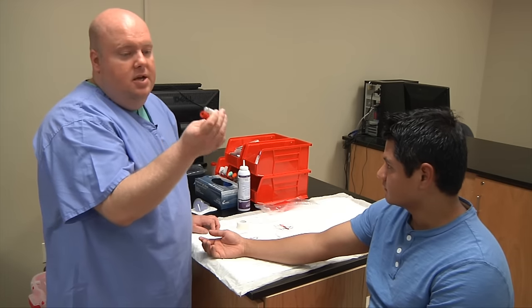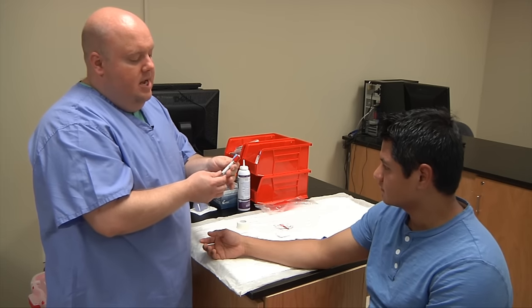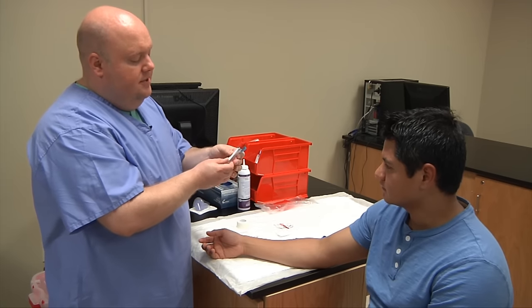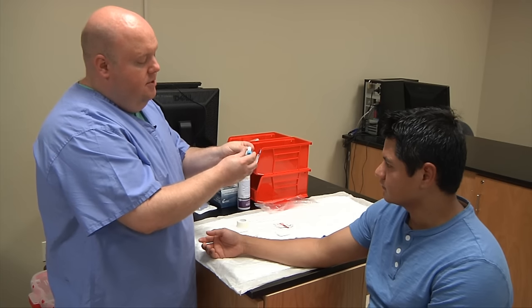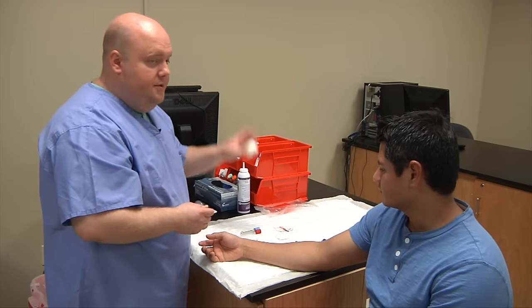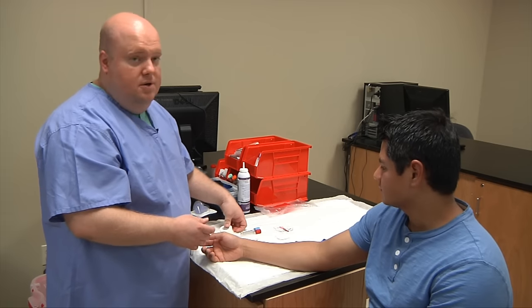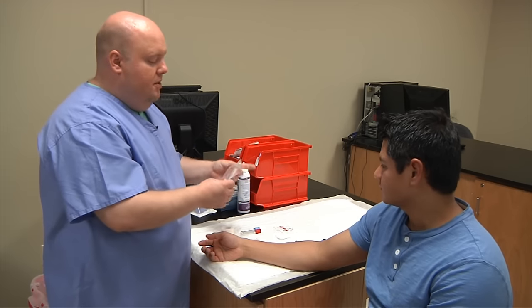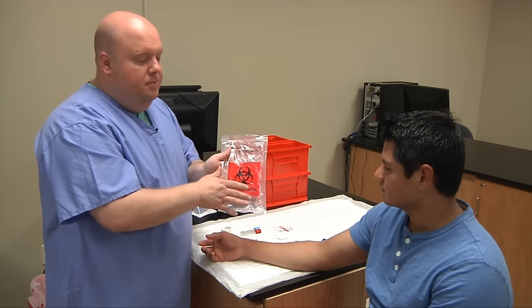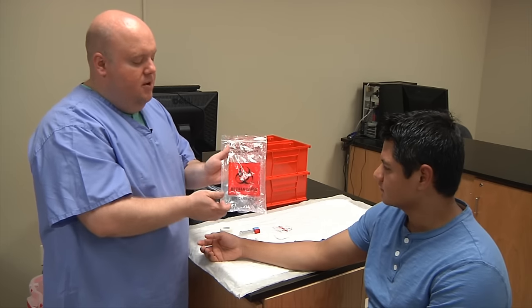You'll need whatever evacuated tubes you'll use. In this instance I'm going to use a serum tube and a coag tube. Check the dates on these tubes, make sure they're both in date, and make sure they're new with no punctures or marks. I also have paper tape — if your patient is allergic to paper tape, you would consider using Coban. I also have my lab sample bag; note the biohazard label. Anytime we send blood, urine, or any body fluid specimens, we need a bag with the biohazard symbol on it.